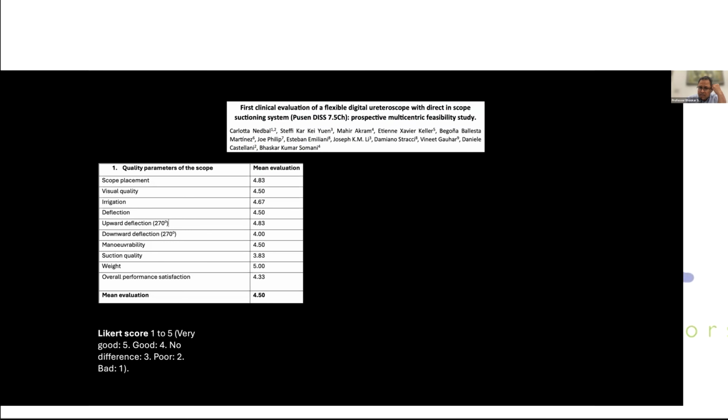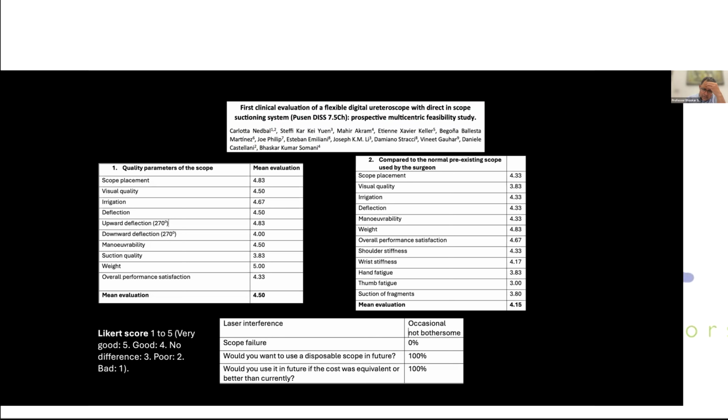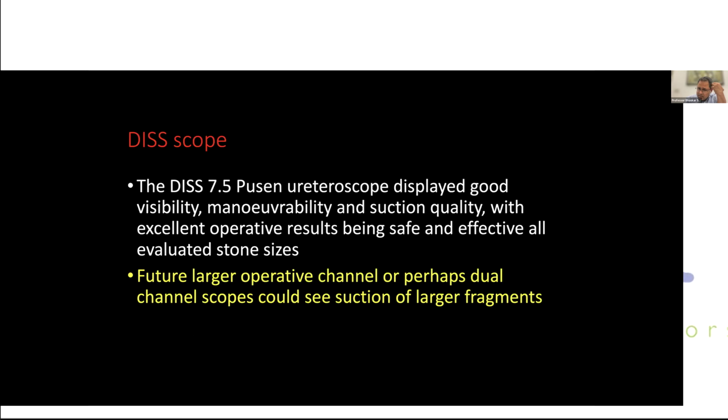So we then asked the clinicians about different aspects, about quality of scope, and if one was not good, etc. Most of them scored very good, or between 4 and 5, similar with the pre-existing scope placement, visual quality, and so on. Most scored between 4 and 5. There was not really that much laser interference, and most people, if cost wasn't an issue, would prefer to use a suction disposable scope.